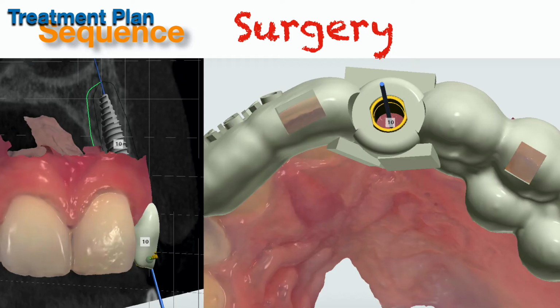But I think that also depends on the biotype of the person. If you see through some of these CBCTs, you can only see the root eminence of the adjacent teeth. So she has a thin biotype. Given that, choose the absolute minimum. You really want 3 millimeters or more long term. Absolutely. So yes, we can do the implant, but I already know that I need to do more augmentation. And that's what we planned.